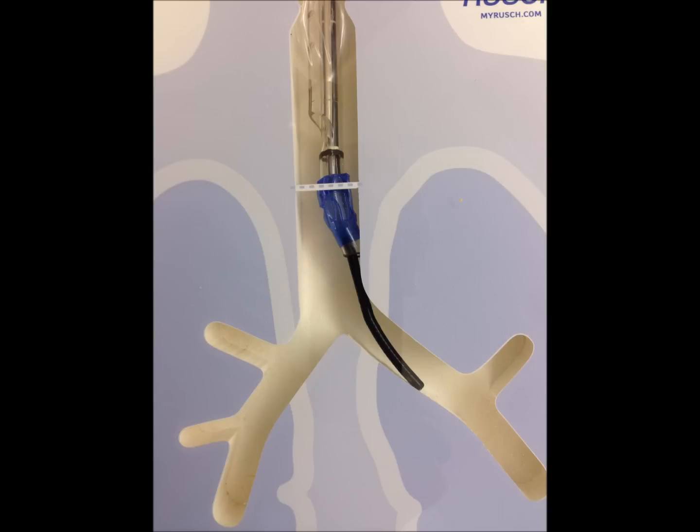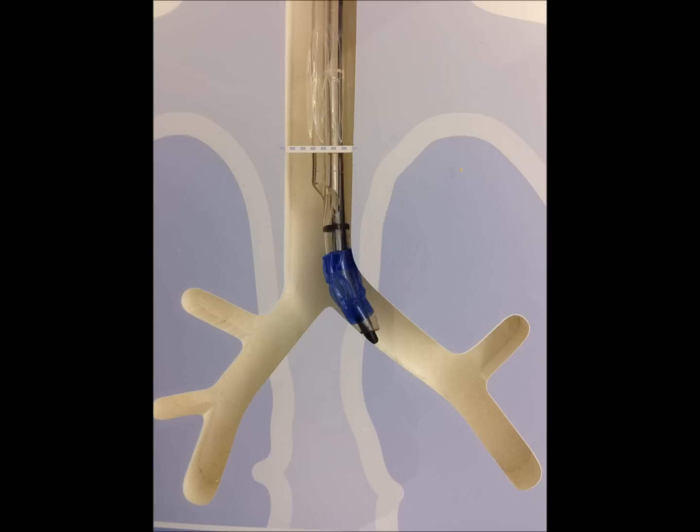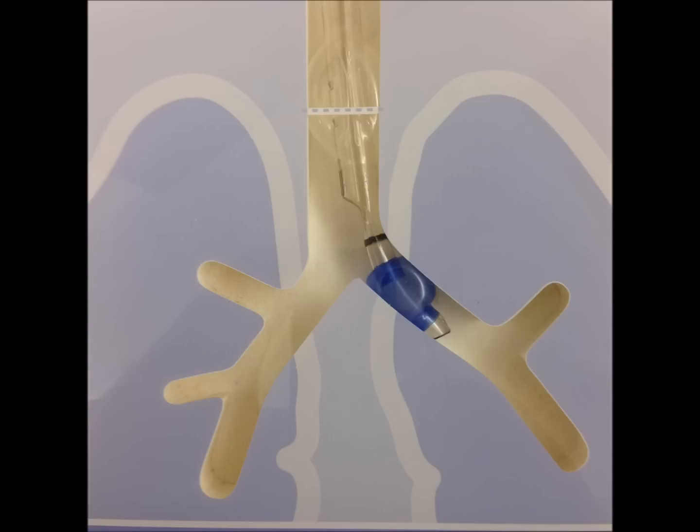Go down the left endobronchial lumen and visualize the tracheal carina. From that point, you can see clearly that the fiberoptic scope needs to go down the left. Visualize the bronchoscope moving down the left, and then you can thread your left endobronchial tube down the left side. If you advance the bronchoscope into the left side, the tube almost always easily follows. Here you can see we've started to advance the tube — pull back the bronchoscope just a little bit, but be careful because if you pull it back too far, the tube can go somewhere else. This is a perfectly placed left endobronchial tube, right where it needs to be.